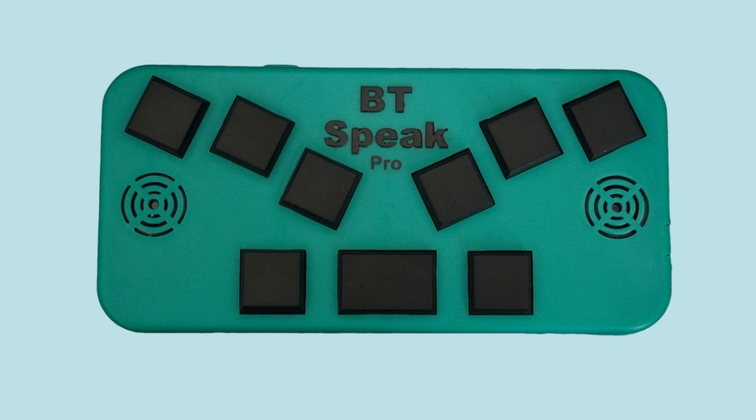Now, dots 2 or dot 5 does this with words. So if I want to move to the next word, I press dot 5 chord. 2 things were certain. Okay, if I want to move to the previous word, I press dot 2 chord. Were things. 2. There we go. Let me move to the word things. Things. If I want to read the current word, I press both keys, dots 2, 5 chord. Things. And it read the word things.